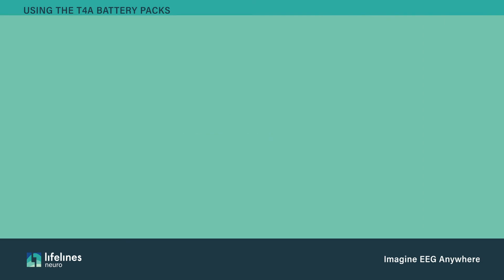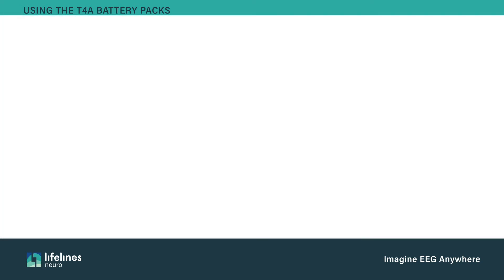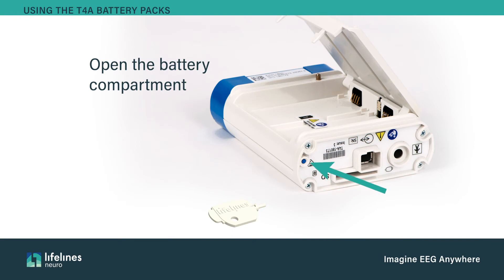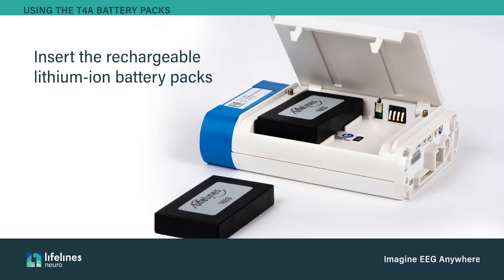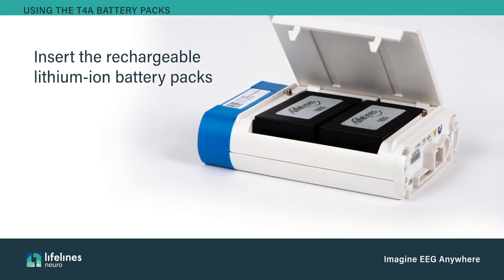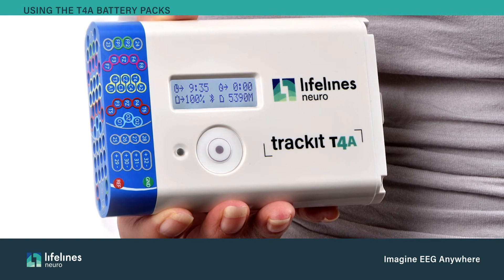Batteries must be at full charge when inserted into the T4A. If using two, both must be fully charged. Open the battery compartment by depressing the battery release button using the provided tool or pen tip. Ensure the battery door is facing up so the batteries don't fall out. Insert the rechargeable T4A lithium-ion battery packs. Once the door is closed, the display will show the capacity of each battery pack.